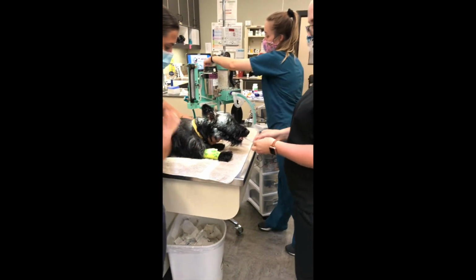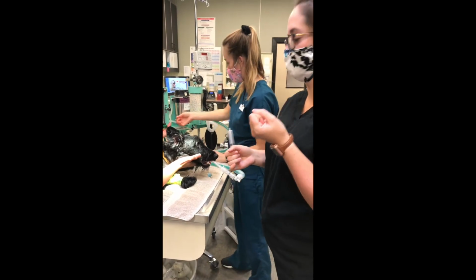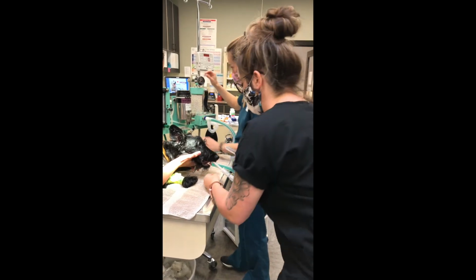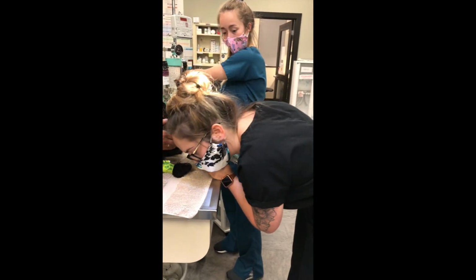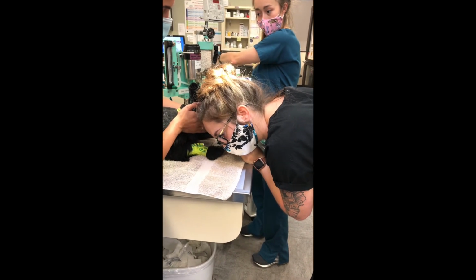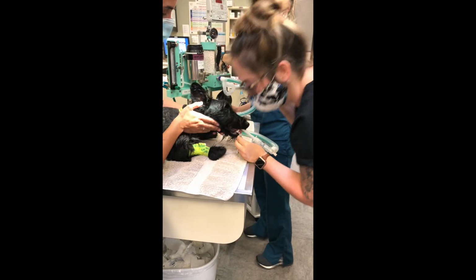Now to inflate the cuff properly, we're going to hook him up. Megan is going to breathe for him, and I'm going to listen for air to flow around the tube, and I'll inflate it until I cannot hear it any longer. Ready? One more time. Sounds good.